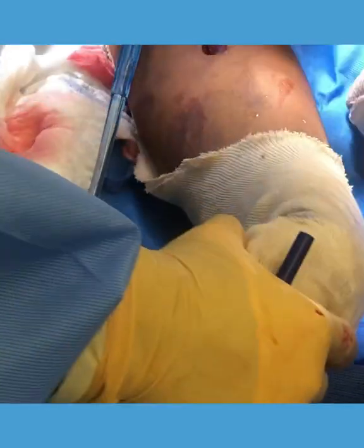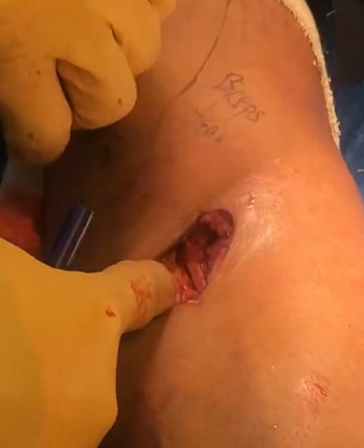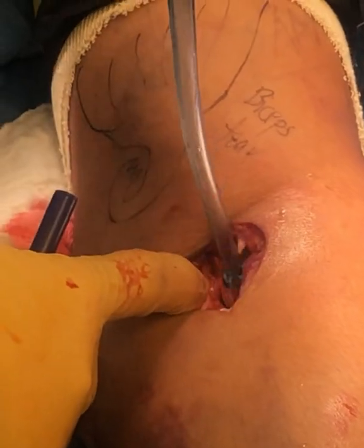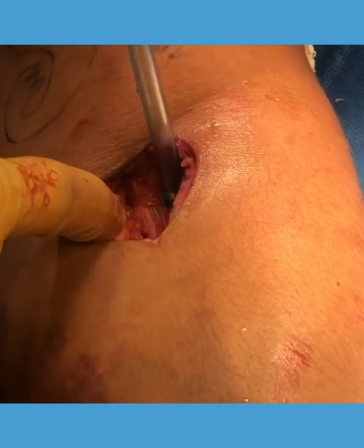And that's what we just did. If you look here, you can actually see our repair — there it is. There's our biceps. You can see that nice gleaming structure right there. That's the distal biceps repair. Let's do it one more time.